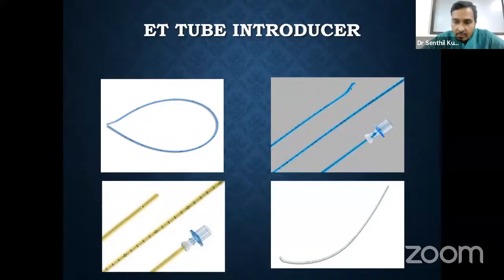If it enters the trachea, you might get a gritty feel because of the placement of cartilages in the anterior part of the trachea. That's why you are supposed to orient it in such a way that the Coude tip is anteriorly placed while you are intubating. So you will get a gritty feel. The second thing is you can introduce it to some extent, to 35 to 40 centimeters, and there will be some sort of resistance after some point.